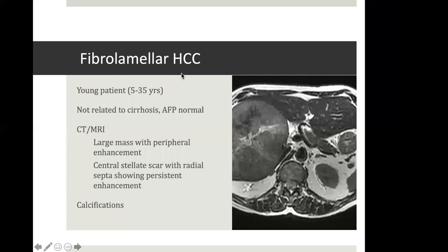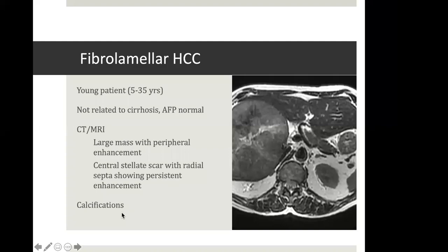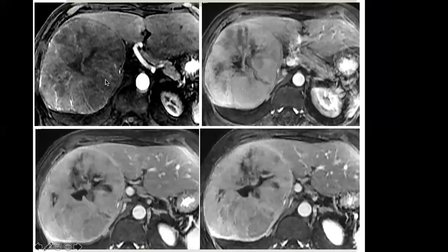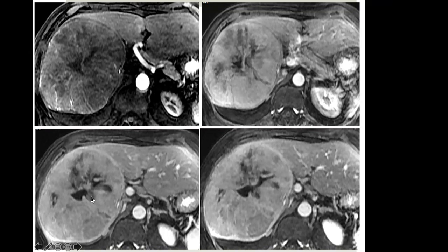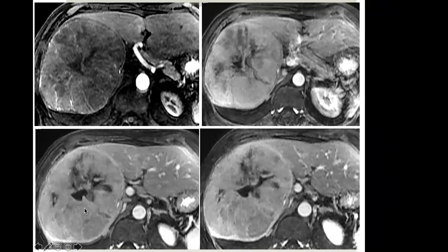There is a special category known as fibrolamellar HCC, seen in young patients, not related to cirrhosis, with usually normal AFP. The classical appearance is a large mass with peripheral enhancement and a large central stellate scar with radial septa that may show persistent enhancement, and sometimes calcifications. In this particular case, the liver parenchyma is non-cirrhotic; there is a huge mass in the right lobe with a central scar and diffusion hyperintensity. Arterial phase images show heterogeneous enhancement, increasing on the portal phase with some washout. Washout is always compared with the background liver parenchyma.